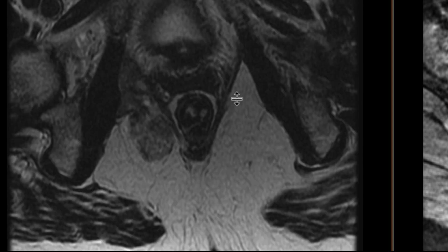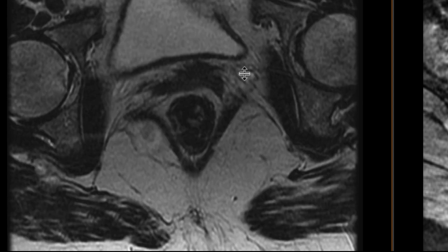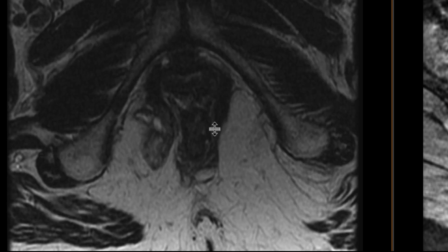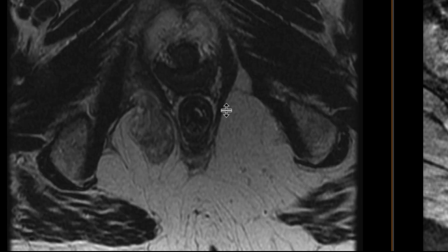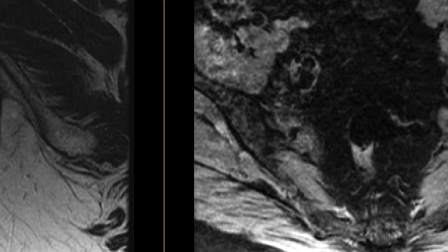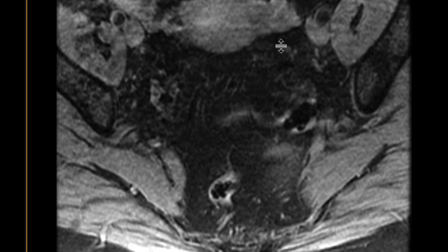Overall, when we look at it and scroll from up to down, we notice that it has this sort of very laminated and almost whorled appearance as it goes inferiorly down to the ischioanal fat.